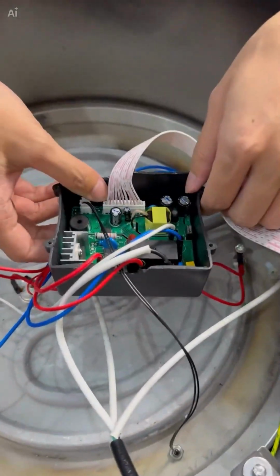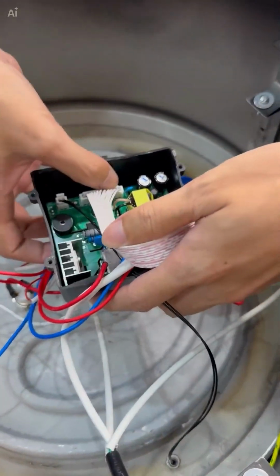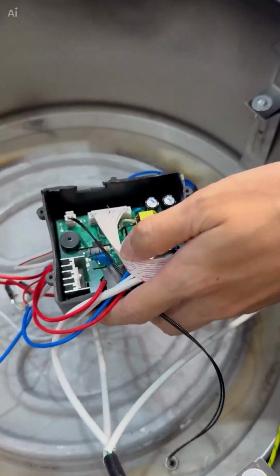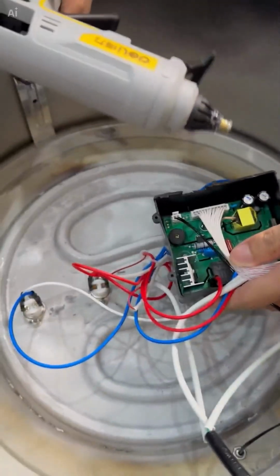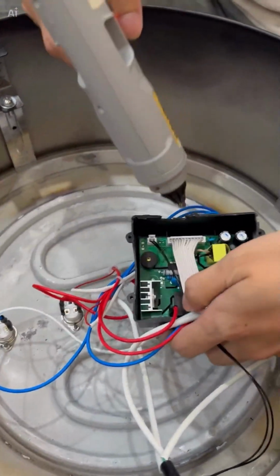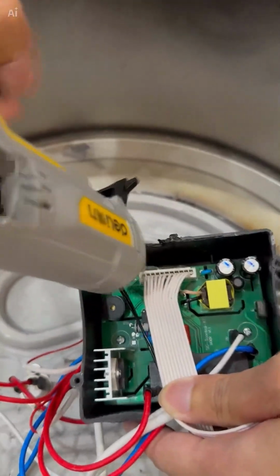Okay, now after we finish connecting the wires, we need to apply some glue here to prevent the wires from coming loose. You need to use this hot glue gun and then apply some glue at this ribbon cable area.